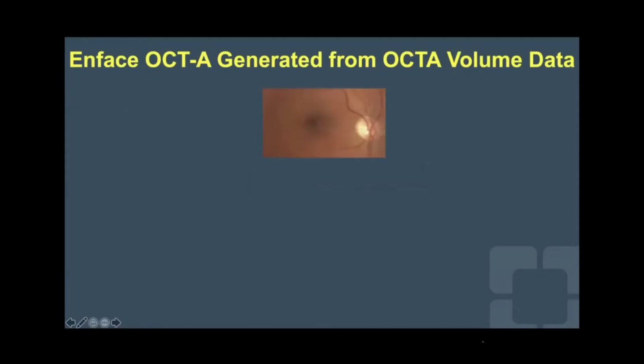So one of the big advances in OCT technology has really been around OCT angiography. And for those of you who aren't familiar with OCTA, this is a non-dye-based angiography test using OCT technology in patients. And what you're doing essentially is you're looking for movement of red blood cells within vasculature. And the reflectance of this red blood cell through a subtraction algorithm then shows you the actual vessel caliber and density in patients using 12 sequential B scans over time.